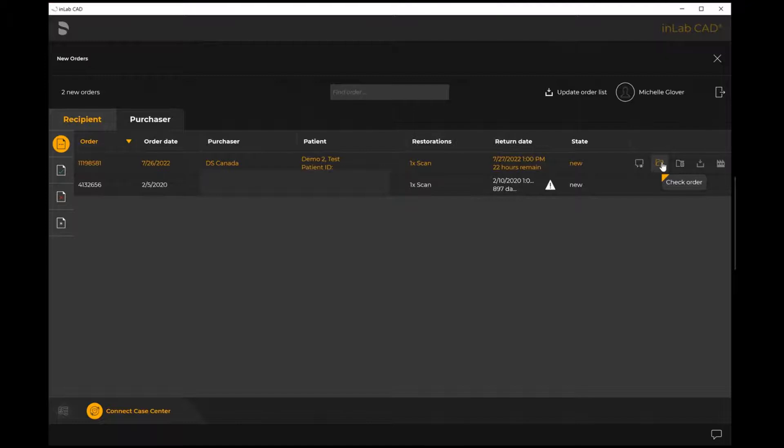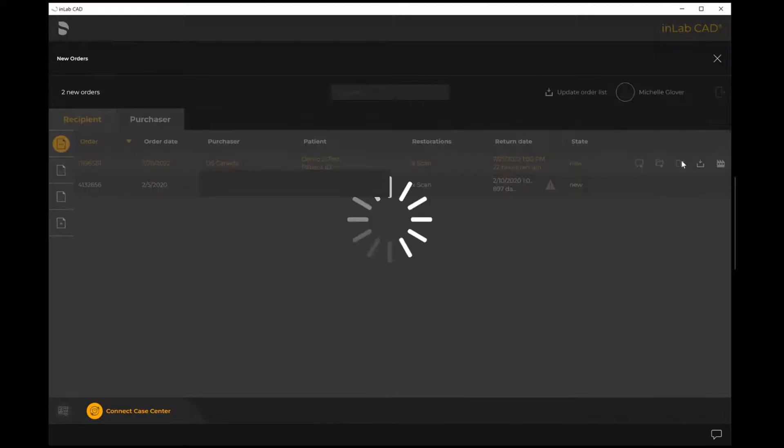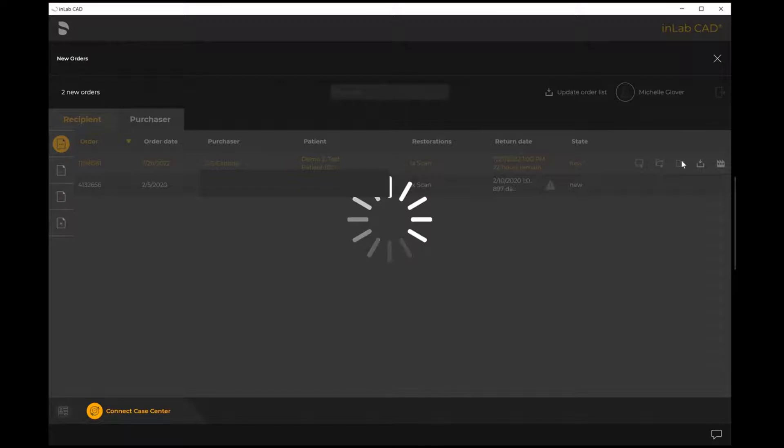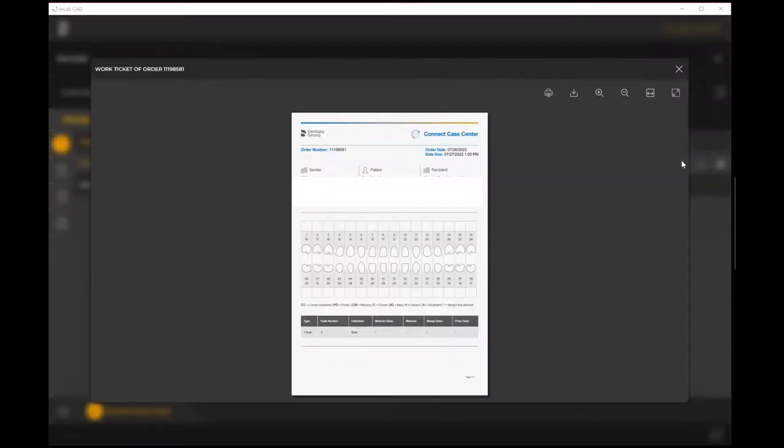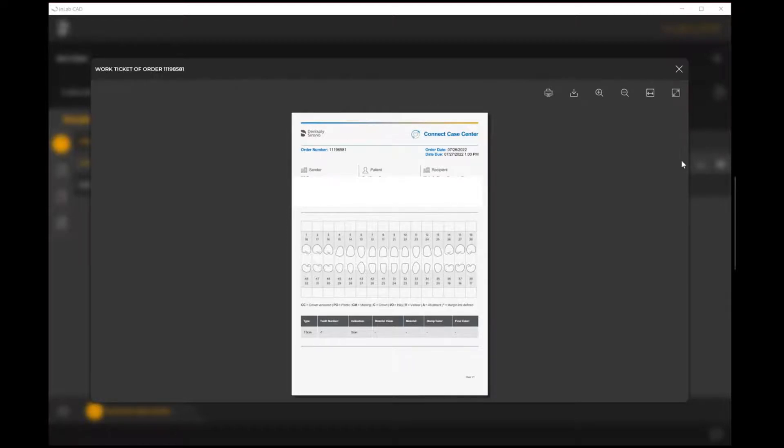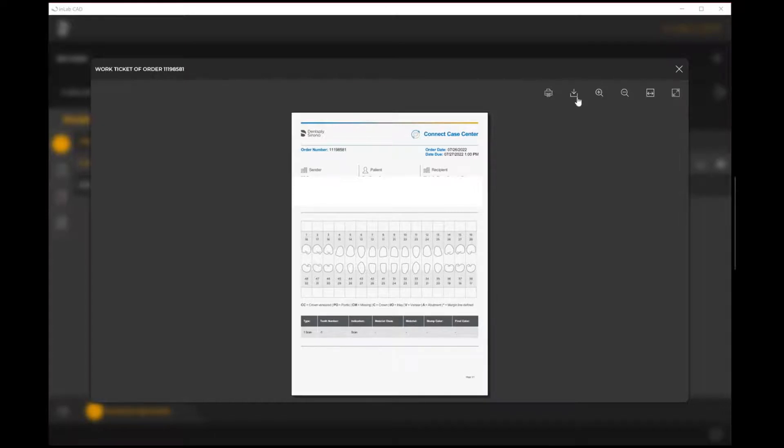The final option here is show work ticket. When you select that, what it generates is a PDF to be able to print for your case pans. This would be your prescription - any of the details that the doctor has provided about the case in question. When it wants to be returned, the details of what you're specifically working on, identifying items like the shade or whatever it might be.